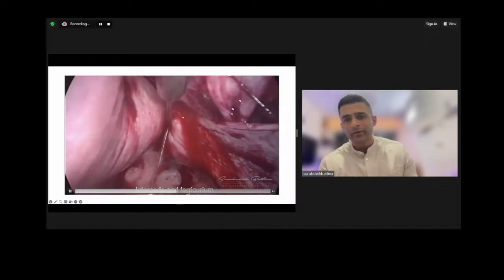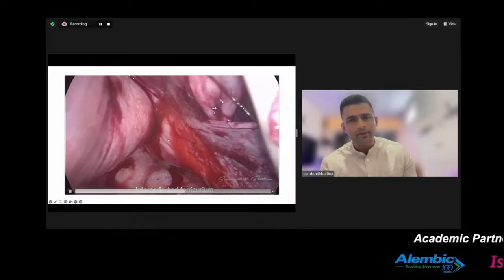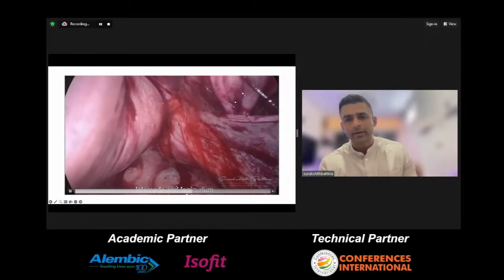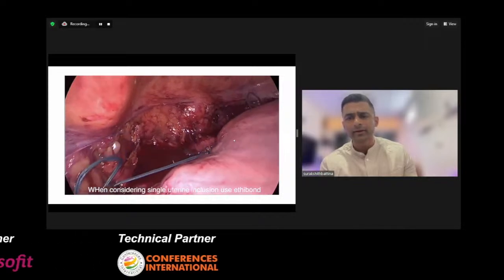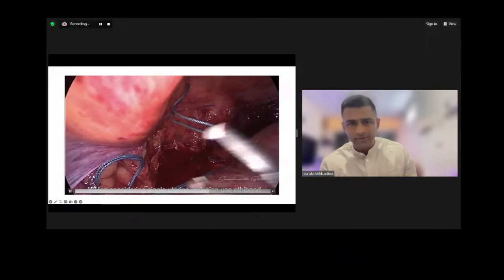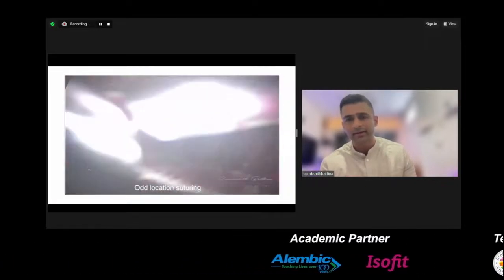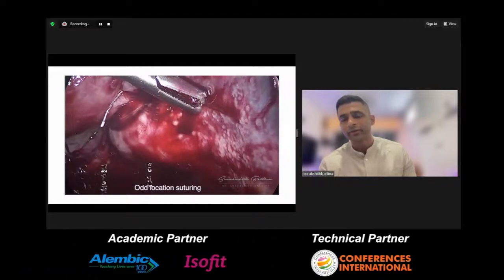And then sometimes you'll also have these odd locations where the bleeding is coming from. That also is not a problem. You can go ahead and bipolarize it. Shouldn't be an issue. But if in case after you tried everything the bleeding still persists, you can go ahead and tie the uterine artery on one side. We have done that for two patients so far, and both the patients had a normal outcome. I mean, she had a C-section at around 36 weeks and no problem at all. So sometimes, suturing is the king.